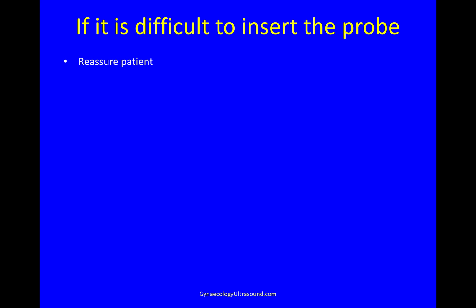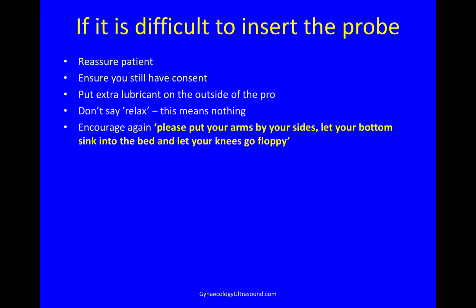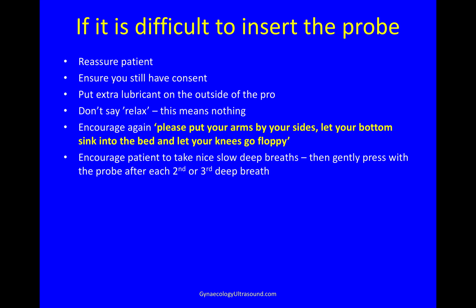If it's difficult to insert the probe, reassure the patient, make sure she's still consenting to what you're doing, and put extra lubricant on the outside of the probe. Don't say relax, because it means absolutely nothing, but say again, put your arms by your sides, let your bottom sink into the bed, and let your knees go floppy.